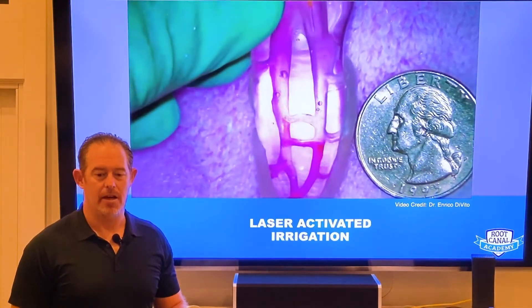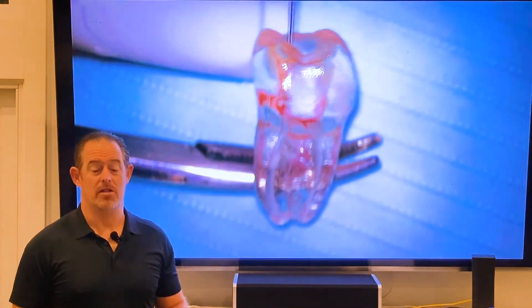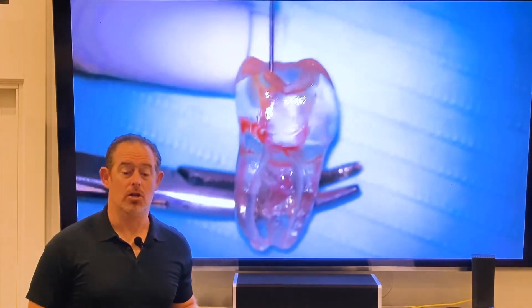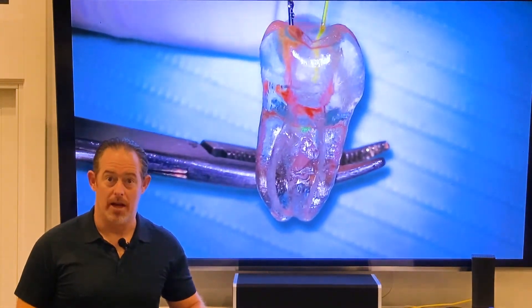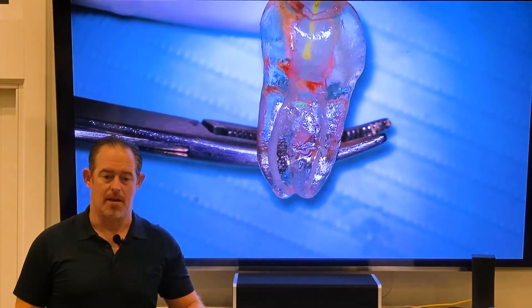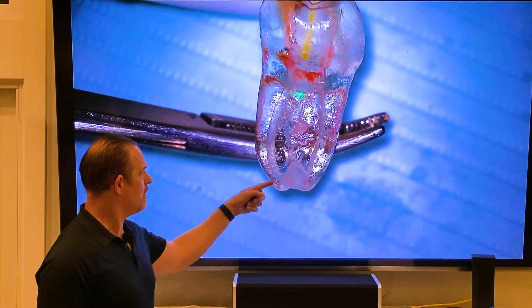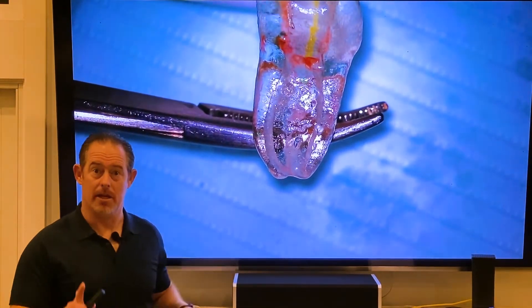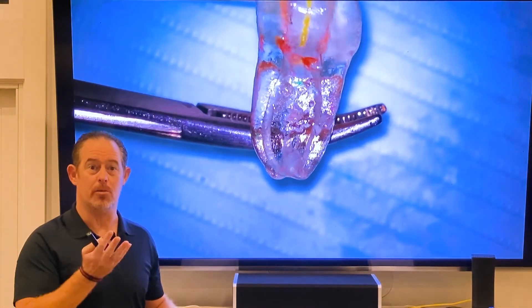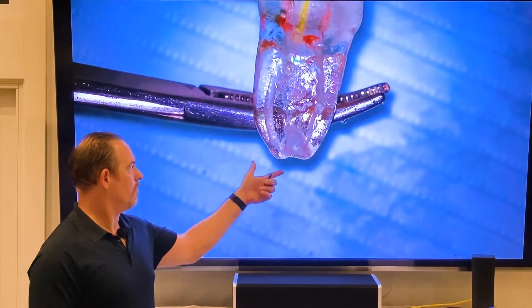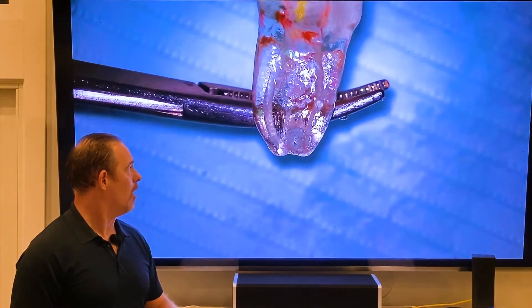The laser-activated irrigation — this is SWEEPS right here. Watch, look at the bubbles. This is a 3D tooth replica, a plastic-type tooth, but look at the bubbles in there and how it goes all the way to the end. Now there's no PDL ligament, so keep in mind there's no ligament to push back on to give that tissue pressure back, so you will get a little bit of things drip out. But with a ligament, that's not going to happen. You can see the bubbles in there and the enhanced disinfection that chemical activity that you're going to get.